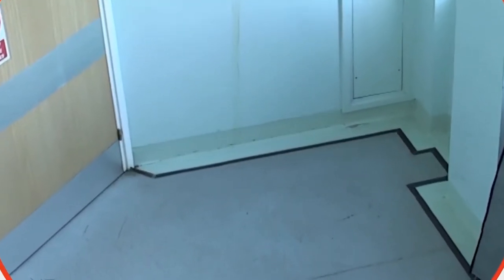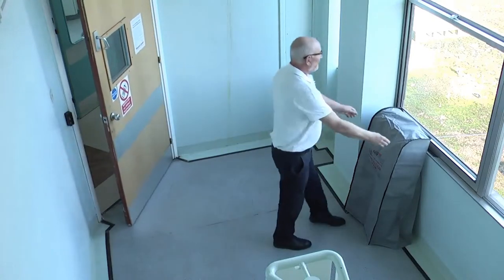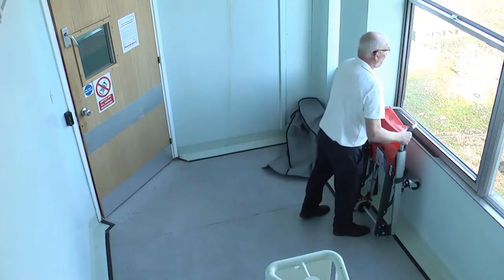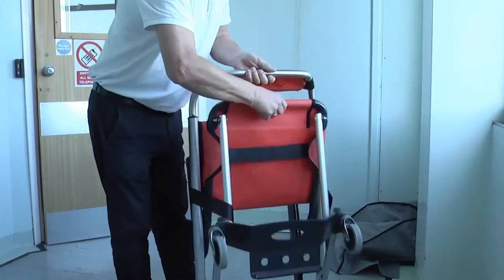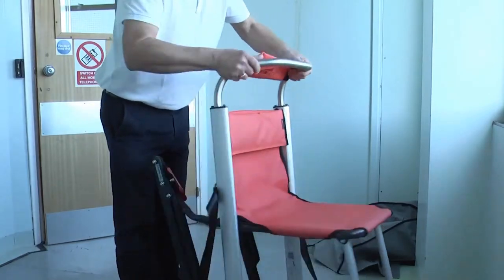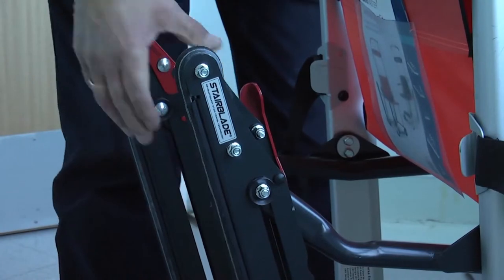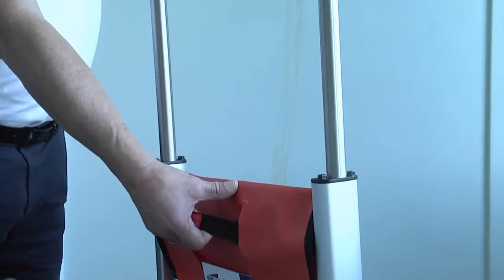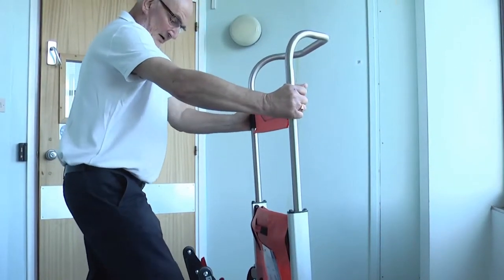The Versa Evacuation Chair is generally pre-installed at a location ready to be used, such as at the top of the stairs or landing area. Remove the product cover and put it to one side. Release the black securing strap and fold out the chair seat before placing the red track locking system into the locked position. Finally, pull the black pull strap located on the back of the chair with one hand, while lifting the telescopic handle with the other.